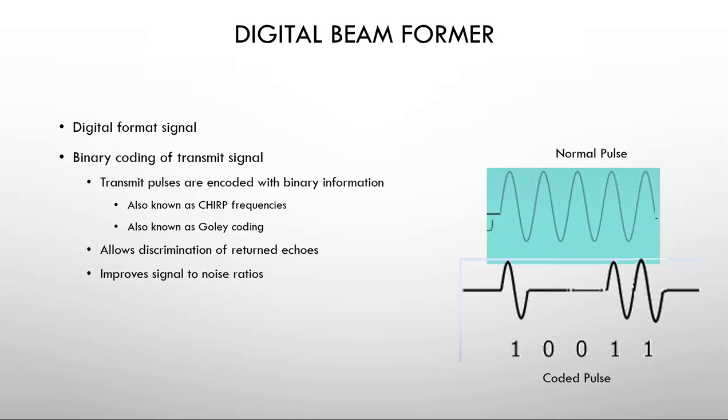This allows us to improve our signal to noise ratio, and that's particularly good because we're not having to raise the signal, turn up the output power. We can just simply lower the noise by utilizing a binary encoded transmission. It's a really good thing.